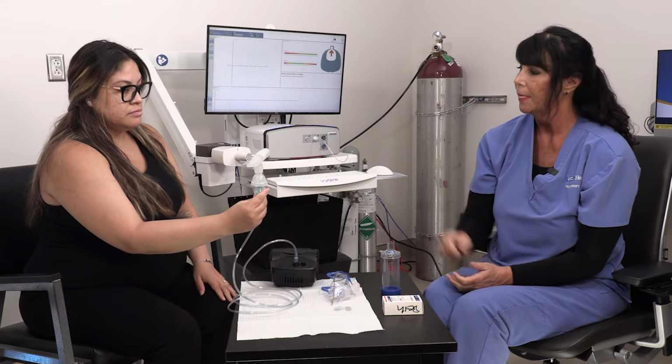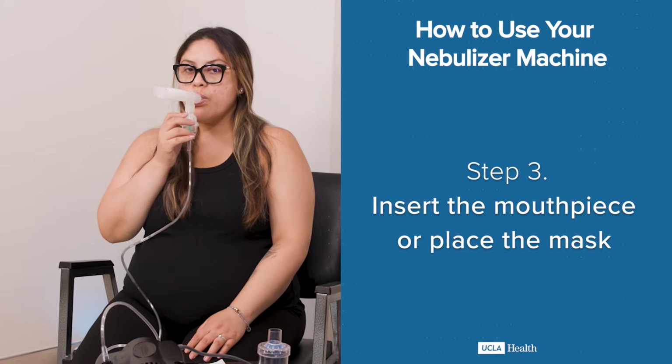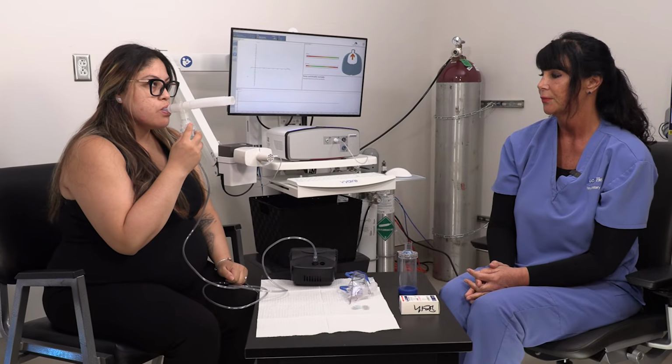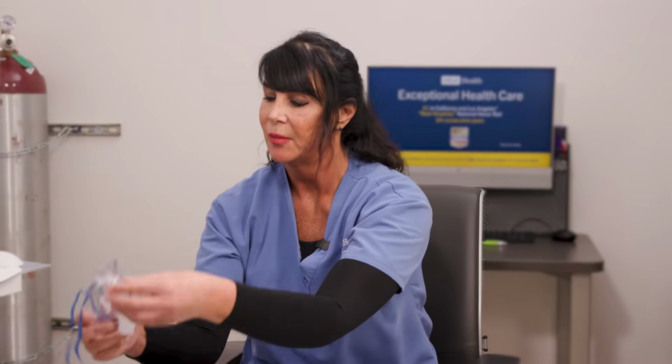Step 3. Put the mouthpiece in your mouth or face mask over your mouth and nose and breathe normally for 5 to 10 minutes or until all of the liquid has been nebulized through the machine. Make sure that your lips make a tight seal around the mouthpiece while breathing in. A face mask may also be used.